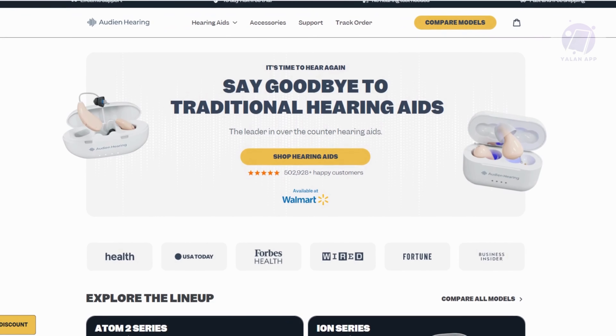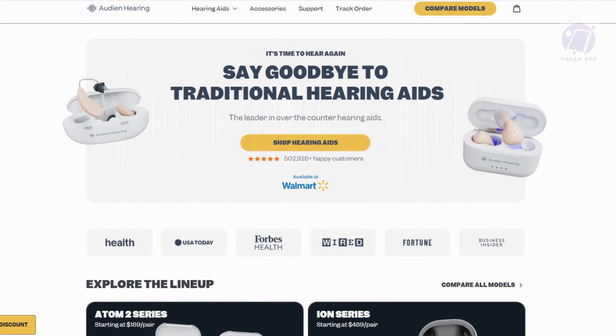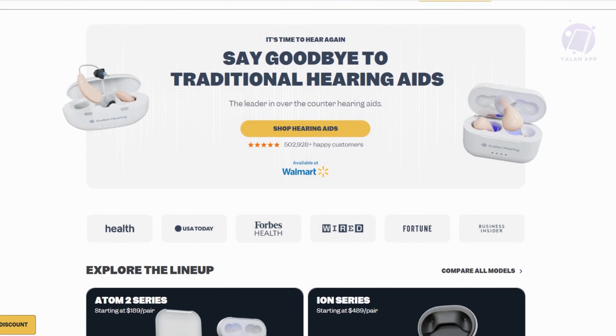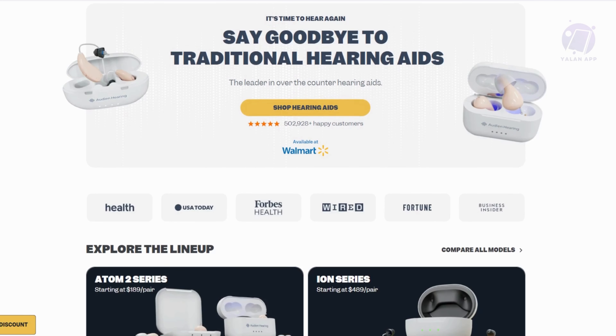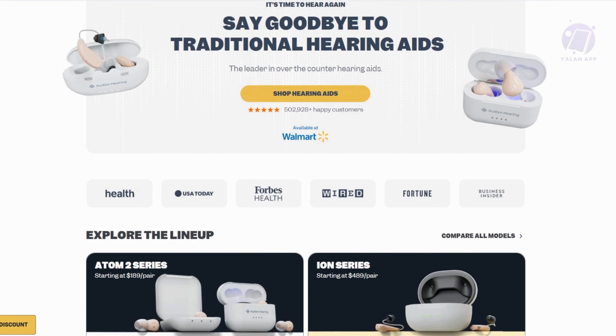One of the big selling points here is how affordable it is. Traditional hearing aids can cost around $4,600, which is a lot, but this hearing aid is only around $249. That's a huge difference, and for someone on a budget, it's a great option without needing to pay thousands.